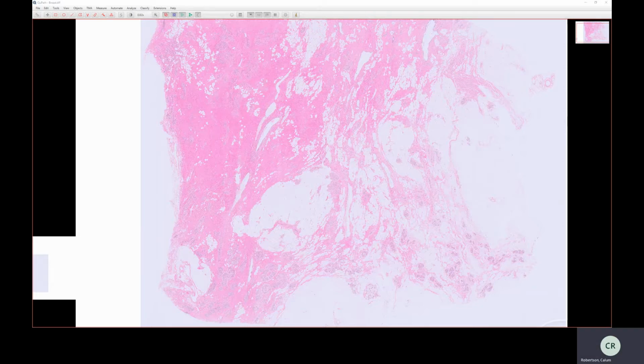That architecture is what you'll find in textbooks, but in practice, both macroscopically when you're dealing with specimens and microscopically when we look here, that structure is not really apparent. And this, what we're seeing here, is what we usually see. So it's not easy to see where one lobe starts and another lobe stops. It's not easy to tell where the collagenous bands that divide lobes are.